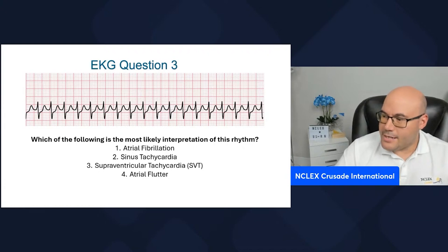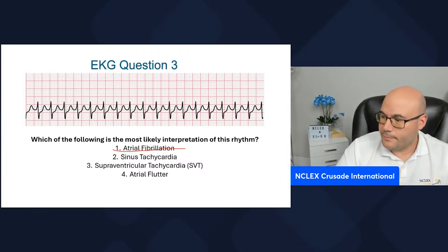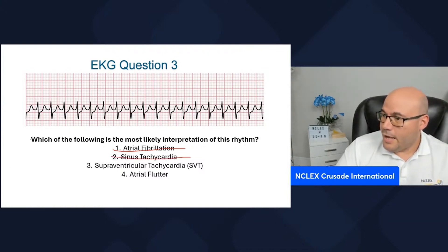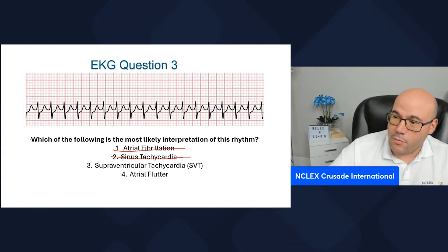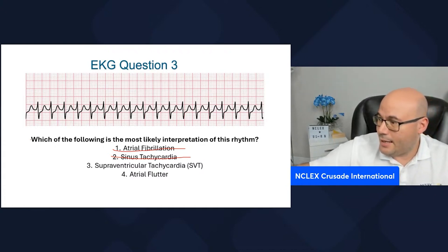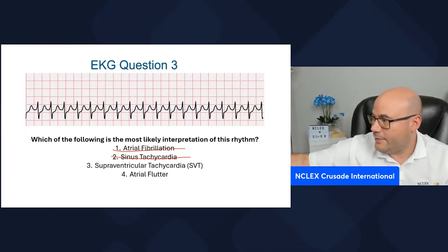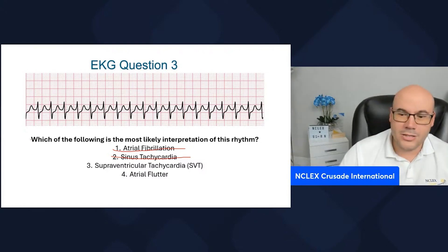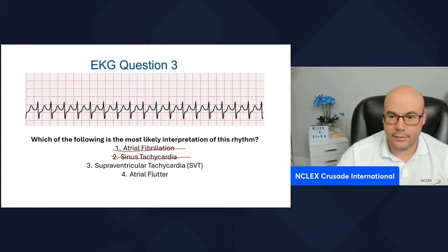So it's not atrial fibrillation because there's no multiple P waves. It's not sinus tachycardia. If we look at the heart rate here, we're counting about 1, 2, 3, 4, 5, 6, 7, 8, 9, 10, 11, 12, 13, 14, 15, 16, 17 — almost 180 beats per minute.